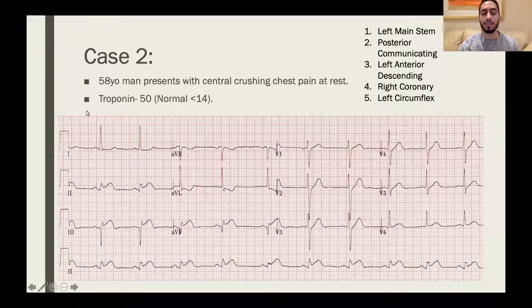All right. Hopefully by looking at this ECG, we had a systematic structure of looking at the ECG, right? So if you start off, obviously patient details and whatnot, you start off by looking at the rate. Doesn't look too bradycardic or tachycardic. If you count the number of squares between, it won't be below 60 and it won't be above 100. If you look at the rhythm, is it sinus? P wave, QRS, P wave, QRS, P wave, QRS. Yes, it is by definition sinus rhythm. Is it regular? QRSs are regular and there's no missed QRS complexes, so it seems to be a regular rhythm.